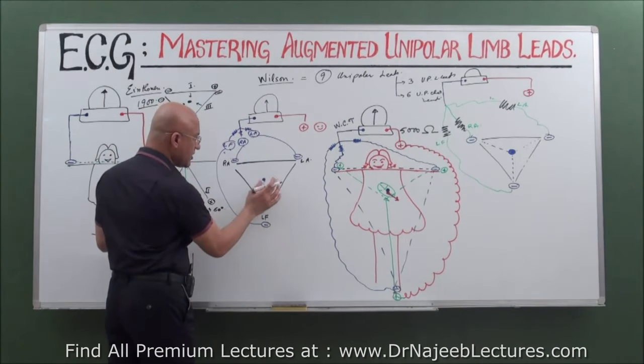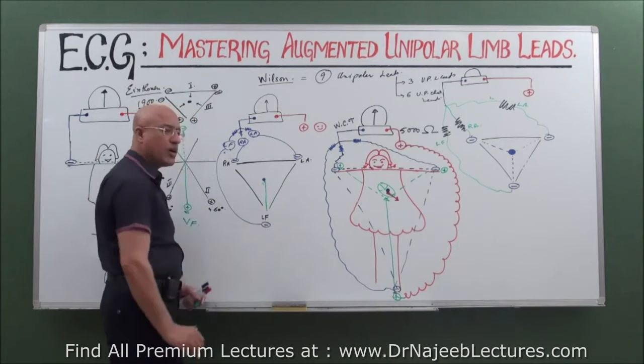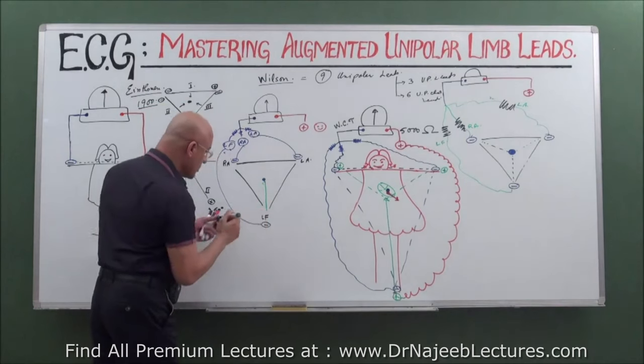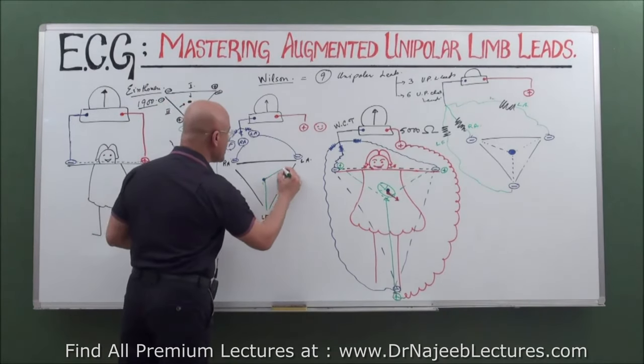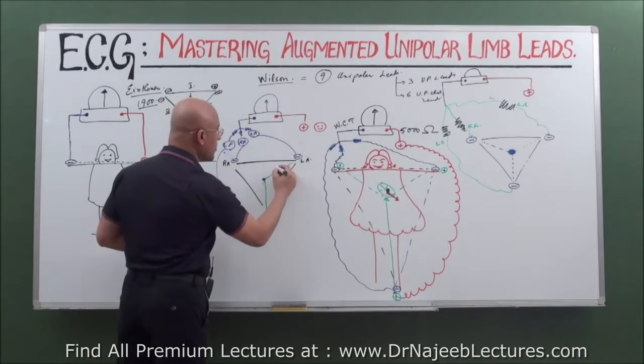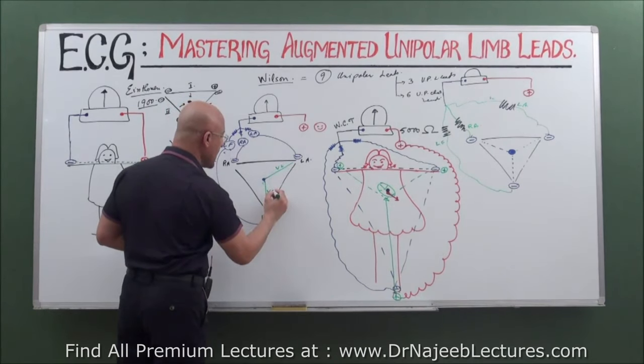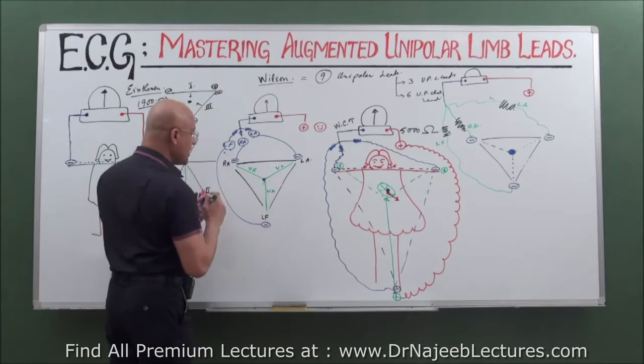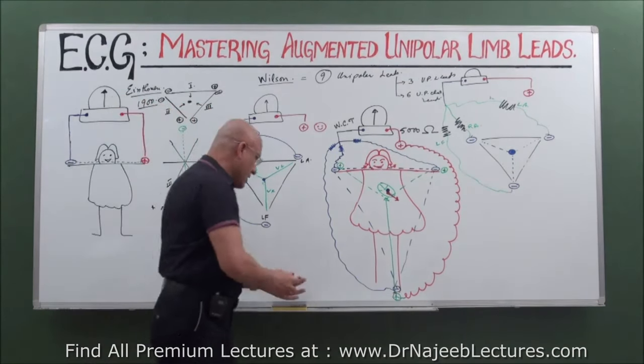VF. This is aVF? No, not aVF. VF. It is VF. And what is this? VL. VL. This is VF. And what is this one? VR.